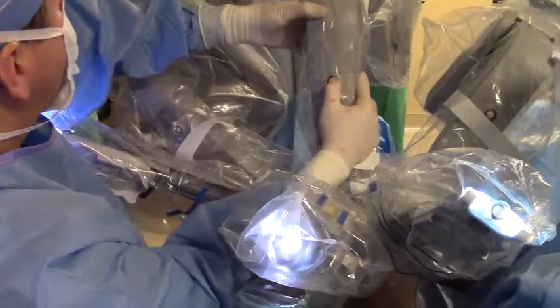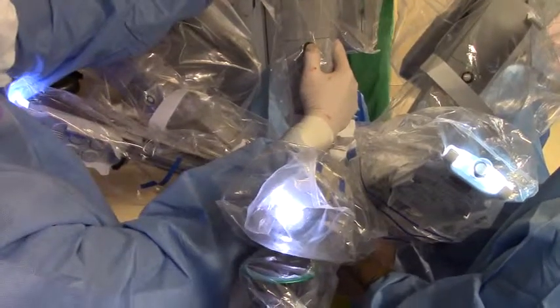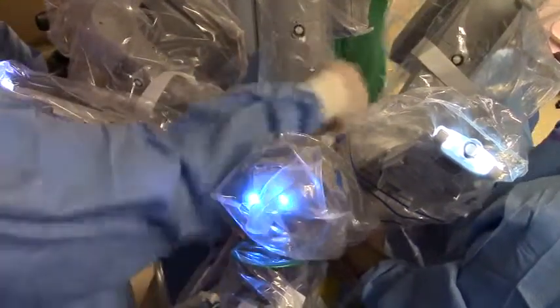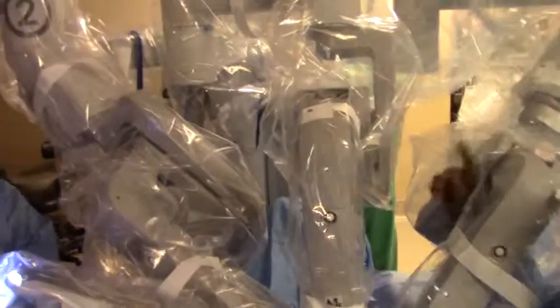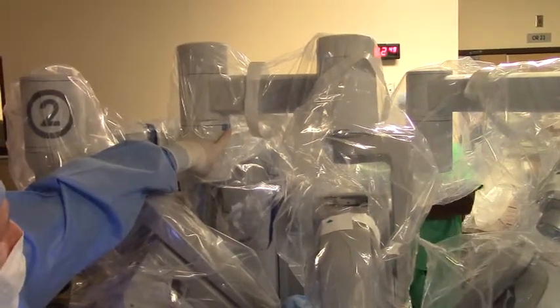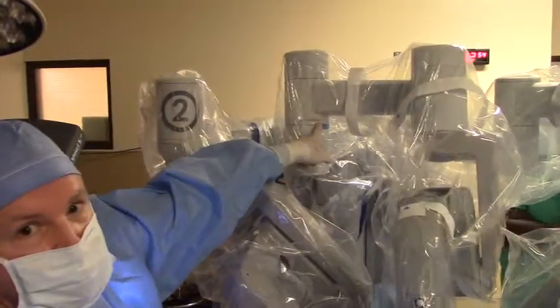And then the last thing we do is we'll get this — and you can see it's kind of in the sweet spot right there. If you angle this out and drop that to the sweet spot right there, see what this elbow did right here? It centers over here. So now you've got room here, room here. The air seal gets in the way here a little bit, but they can adjust that. The sweet spot is just within two fingers right there. I angled this arm over that way to drop it into that, and now my camera sits right in the middle.